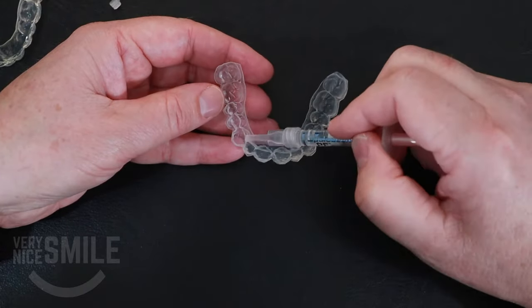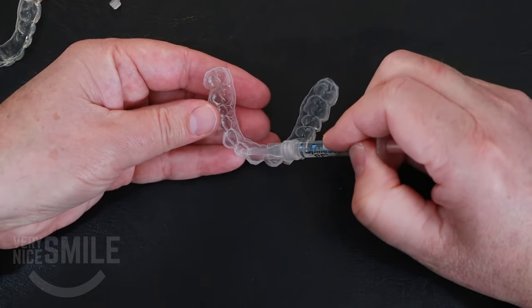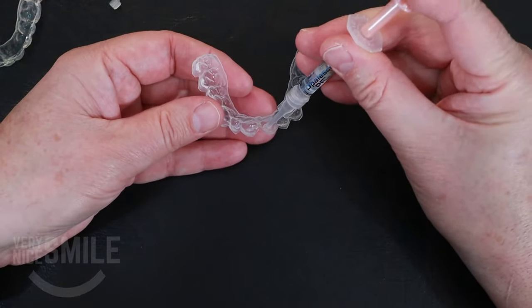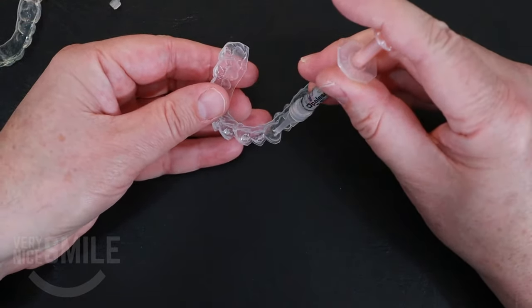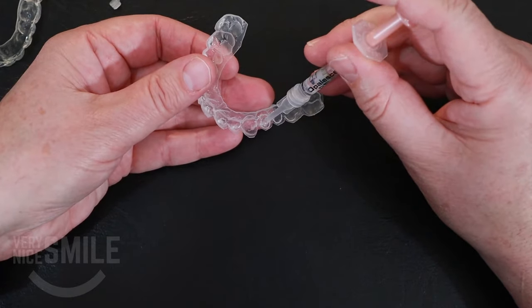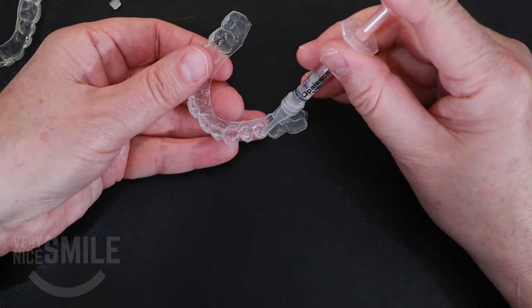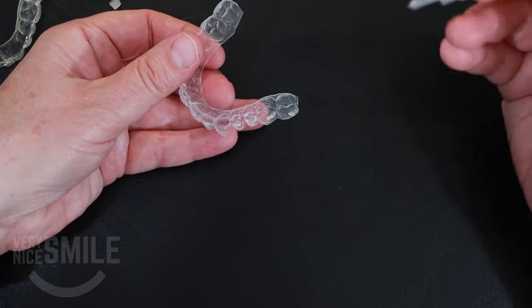Then just as you go, do the same thing — a little blob, pull off, a little blob, pull off, a little blob, pull off. Just kind of wipe it on the in-between spots as well. It's pretty sticky, as you can see — you can actually pull it back up into the syringe if you're not careful. So: a little blob, pull off, a little blob, pull off, a little blob, pull off.